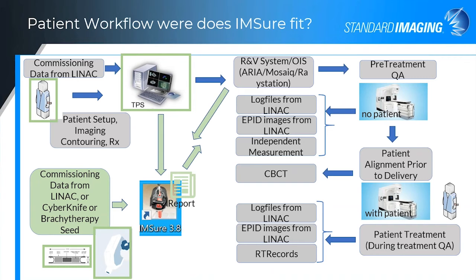So where does QA using IMSure fit into the patient workflow? The gray boxes with blue arrows depict the simplified steps, with the input and output of each step in the treatment workflow. The input and the output for IMSure are depicted in the light green.